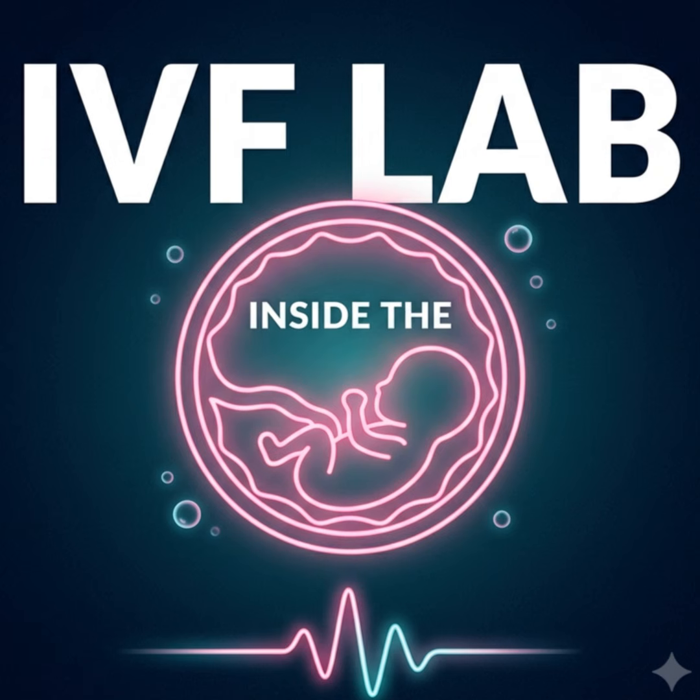Right. And in our last installment, episode 10, we spent our time looking at those final snapshots. We talked about blastocyst development, how the lab grades the expansion of the embryo, the inner cell mass that becomes the fetus, and the trophectoderm that becomes the placenta. Yeah, exactly. But all of it was based on very carefully scheduled static checkpoints. Right. We were looking at the culmination of the first 5 or 6 days of development. But we were evaluating them as distinct, disconnected events. We essentially judged the final frame of the movie without really knowing the plot.